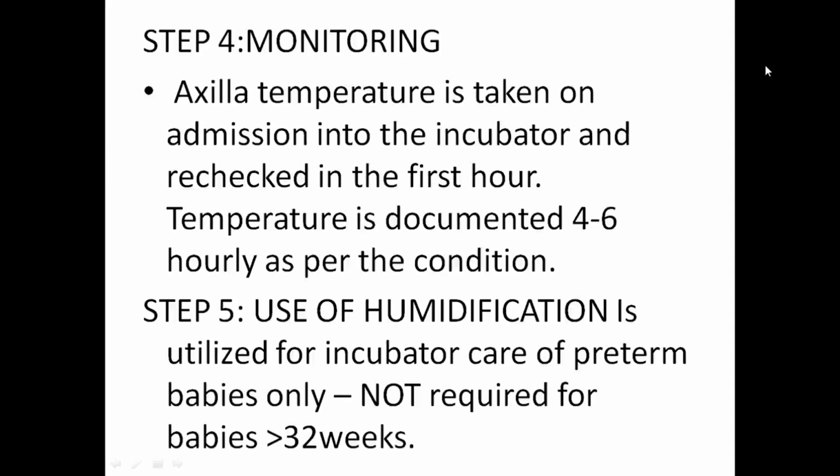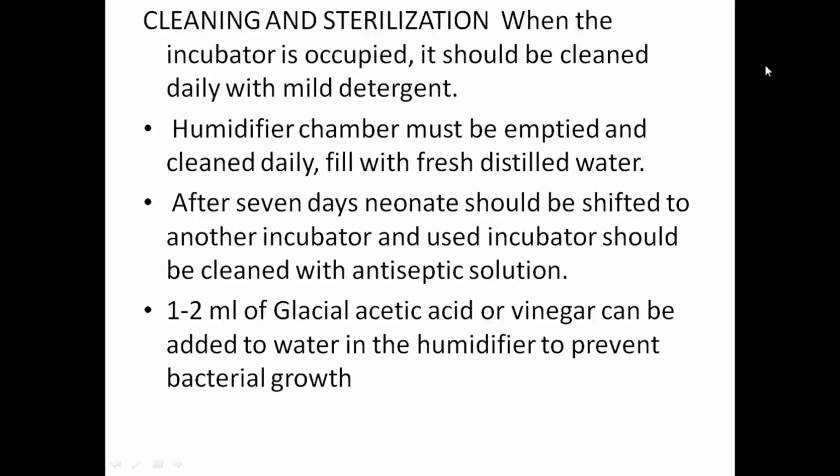Step 4. Axilla temperature is taken on admission to the incubator and rechecked in the first hour. Temperature is documented 4 to 6 hourly as per the condition. Humidification is utilized for the incubator care of preterm babies only, not required for babies more than 32 weeks of gestation. When the incubator is occupied, it should be cleaned daily with mild detergent. Humidifier chamber must be emptied and cleaned daily, and filled with fresh distilled water. After 7 days, neonates should be shifted to another incubator and the used incubator should be cleaned with antiseptic solution.